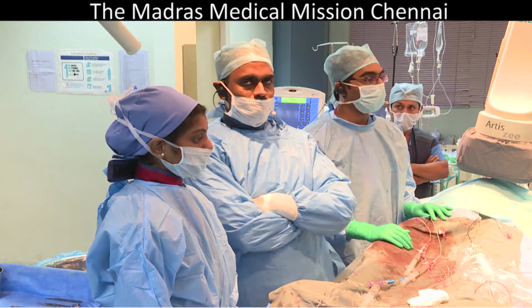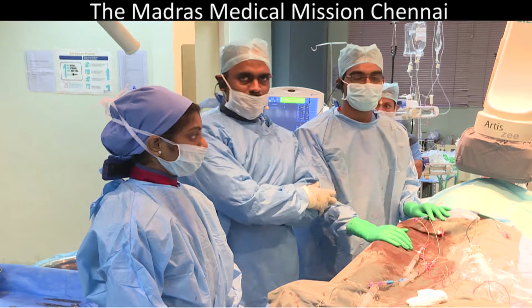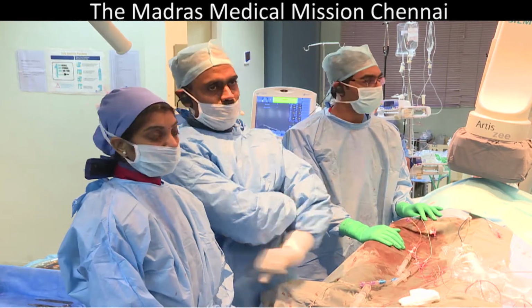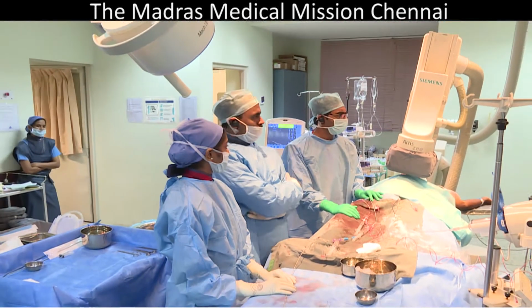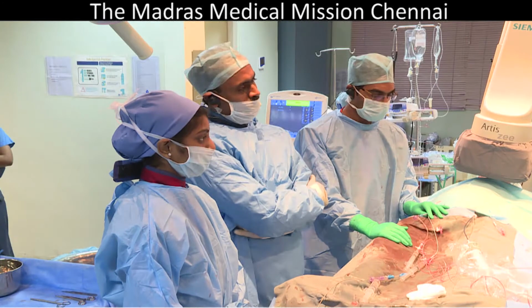So Dietmar, I have with me Dr. Uma Mageshwar, one of my senior colleagues, and nurse Sharmila, technologist Mohammed Alam looking after the patient's comfort, and Janani showing the intracardiac echo pictures.